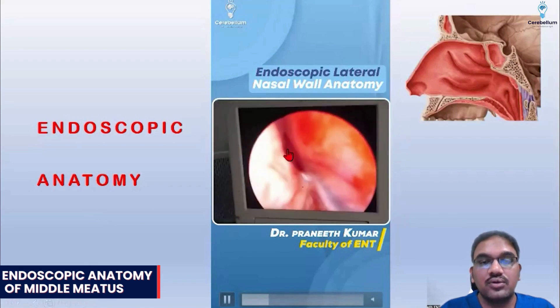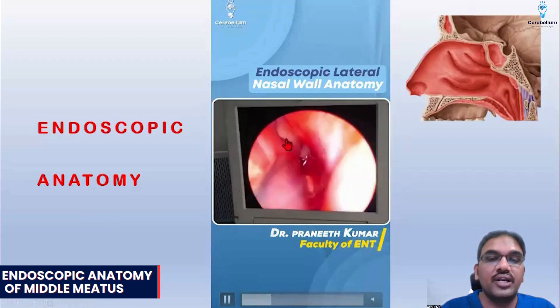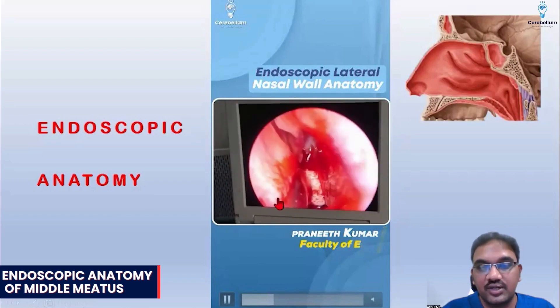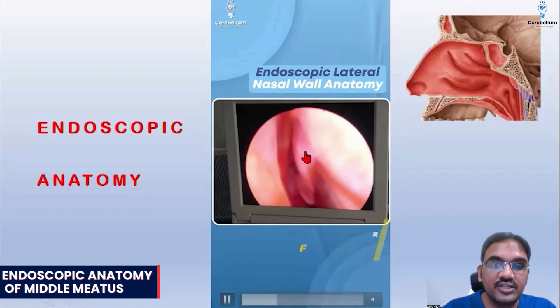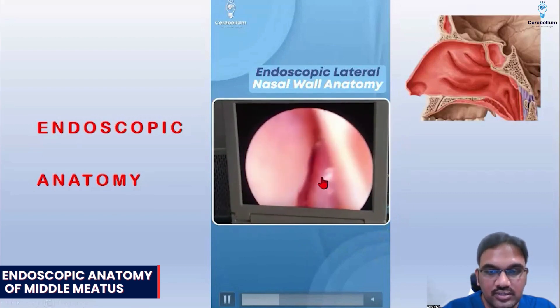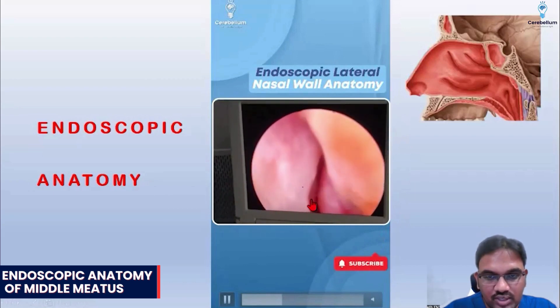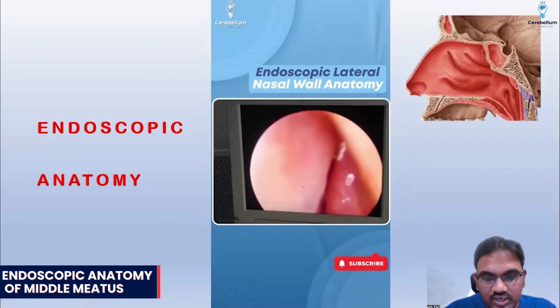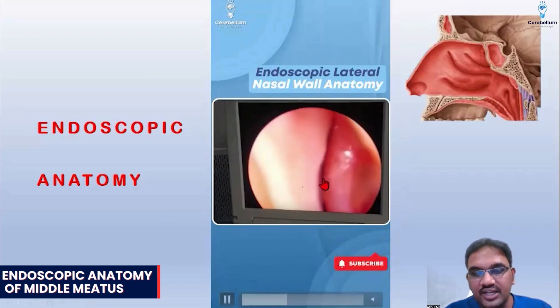Now we are moving on to the middle turbinate. The entire lower part is the inferior turbinate. Now you see this is the middle turbinate. If I medialize the middle turbinate — push it medially — I will see the middle meatus behind it.